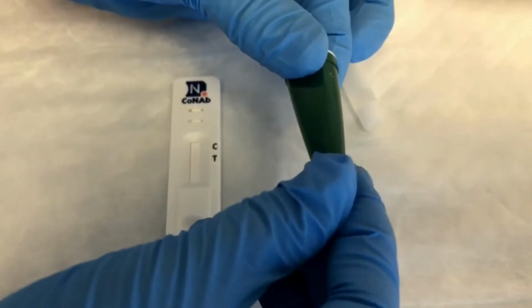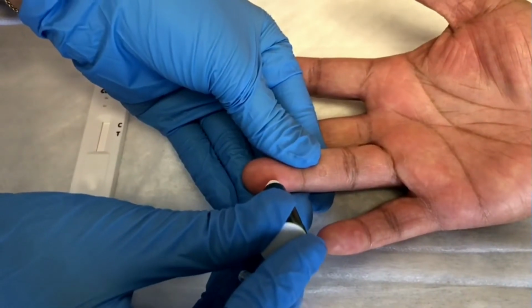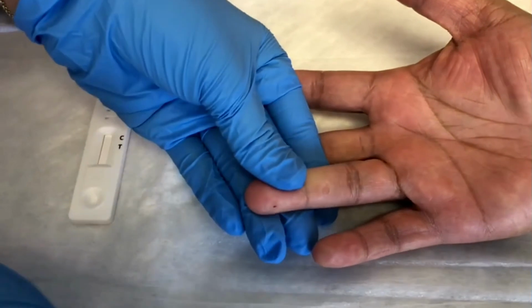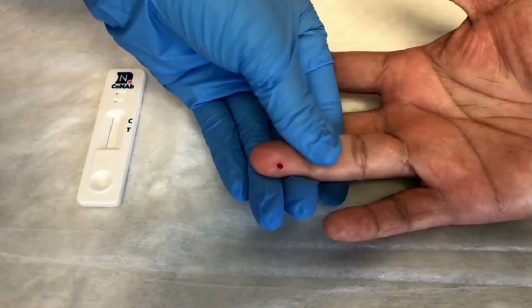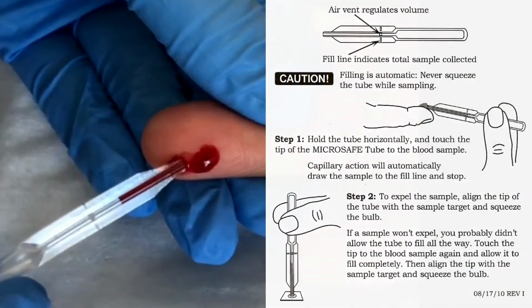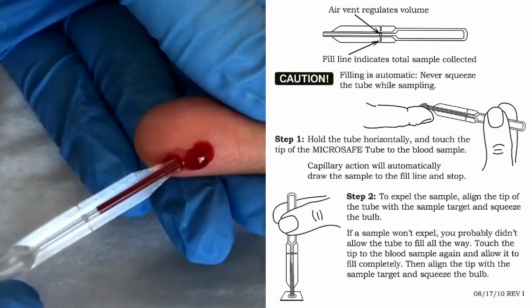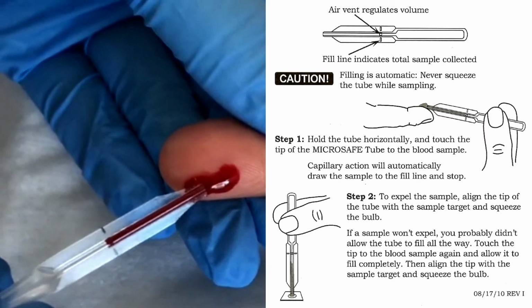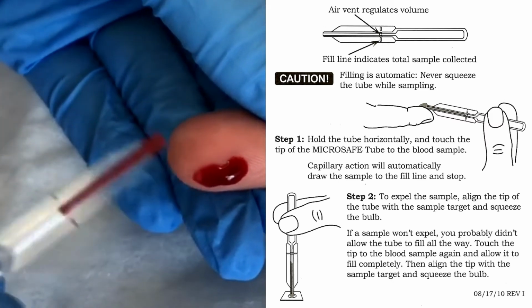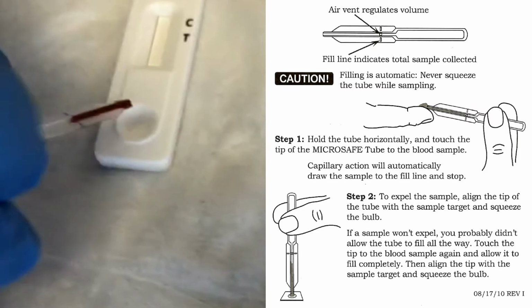Begin by pressing the open tip of the lancet firmly against the fingertip until you hear a click sound. Once the finger has been pricked, a drop of blood should become visible on the surface of the skin. While holding the pipette horizontally, gently immerse the tip of the transferring pipette into the blood droplet. There, the fluid will be drawn up into the pipette via capillary action.